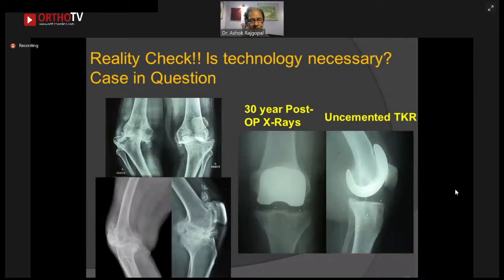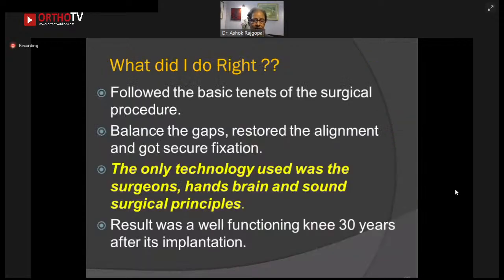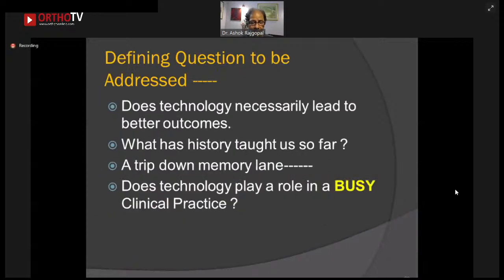Let's look at this very interesting X-ray. This is a patient. This was the third knee that I did when I came back from England. This was done in 1989, so this is actually 32 years. This is a severe deformity, a varus deformity. This is a Freeman Samuelson uncemented knee. She has an uncemented all poly tibia, has lasted 32 years, has 150 degrees of flexion. This lady is an industrialist matriarch. She sits on the floor, eats on the floor, continues to use Indian style toilets. So 32 years without any technology. We really did sound principles, balanced it, and we got a secure fixation.